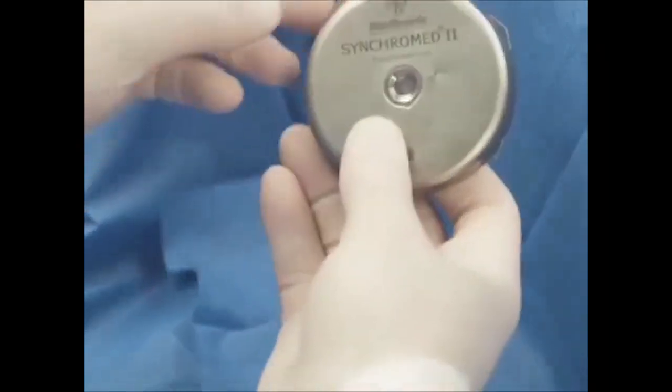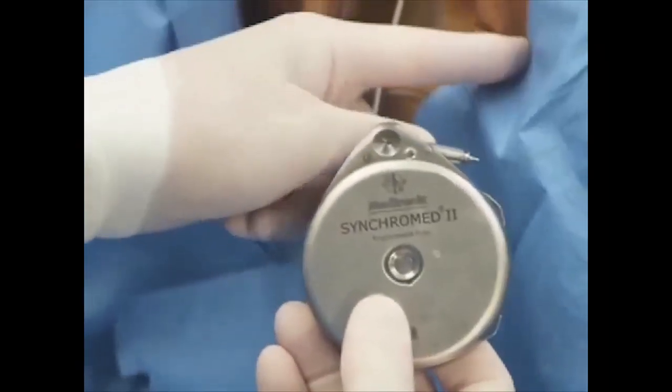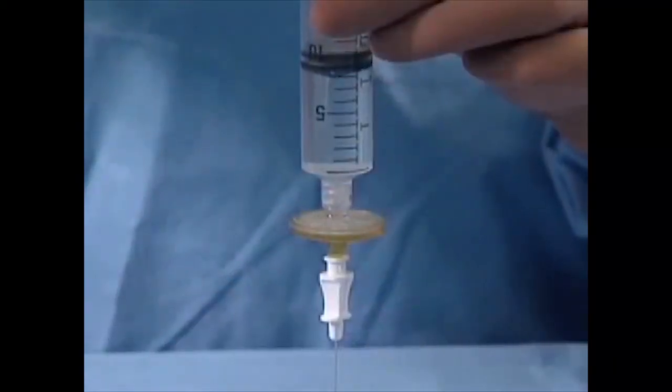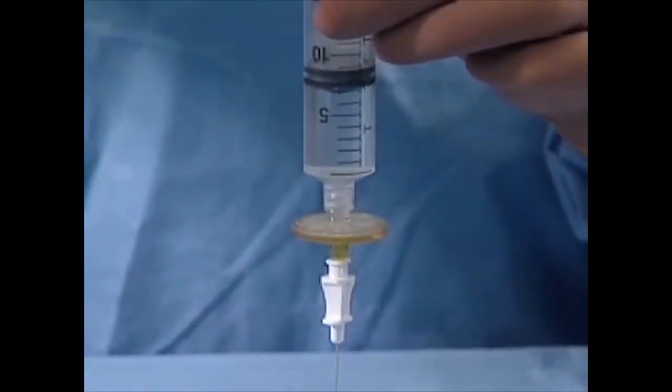At this point in the procedure, make sure that the pump has been properly prepared and is ready for implantation. The pump should have been interrogated to confirm pump function, emptied, filled with the prescribed drug, and flushed with sterile saline at the catheter access port.